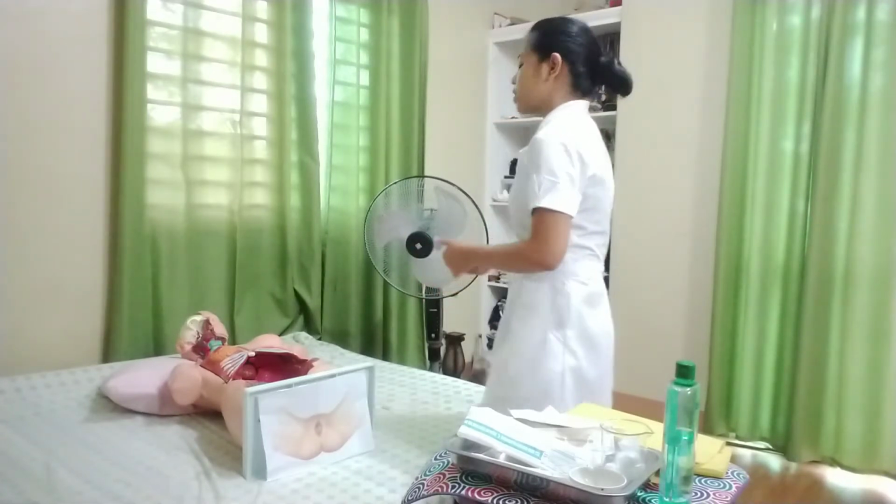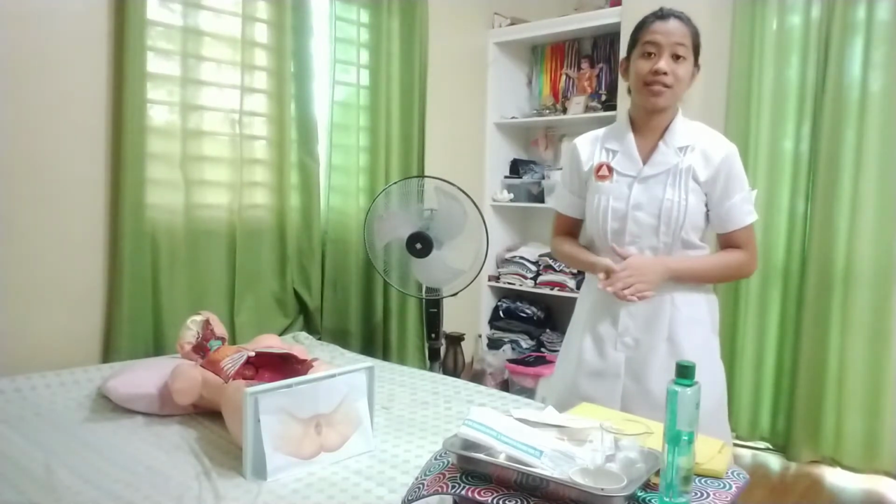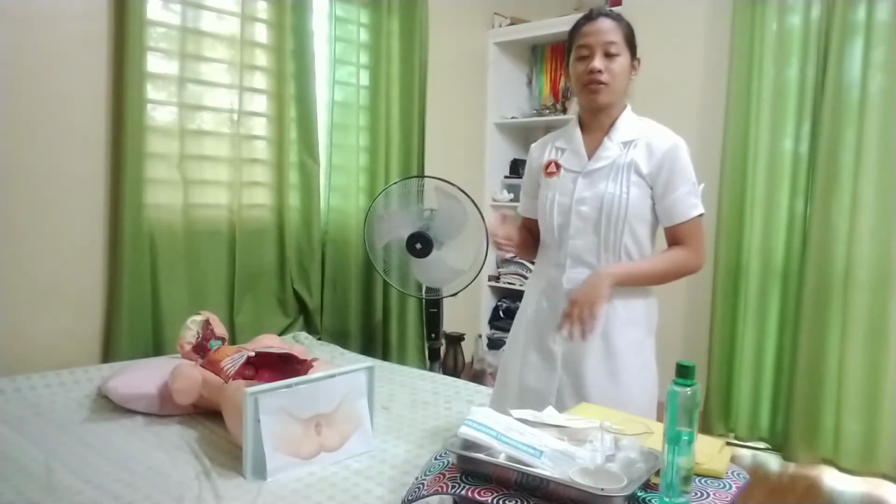Okay, none. That's good. Then after that, I will now provide adequate lighting. This is to give me a clearer visualization of the area once I start the procedure. For adequate lighting, it is recommended to have artificial lighting, usually a perineal light. But if we are going to use a perineal light, we should have someone hold it for us. And then I will now provide privacy for my client, so I will be closing the door of the room and the curtains around the bed.